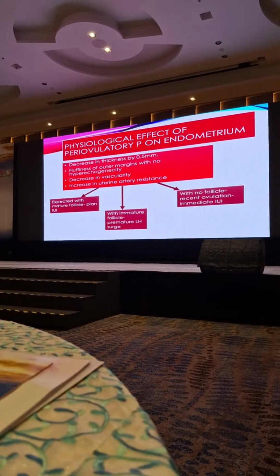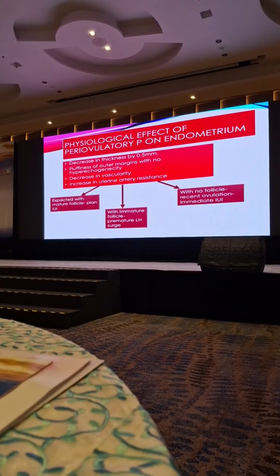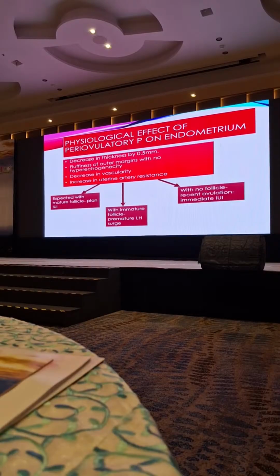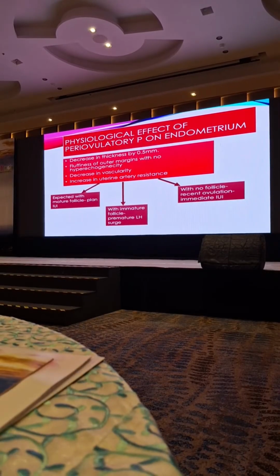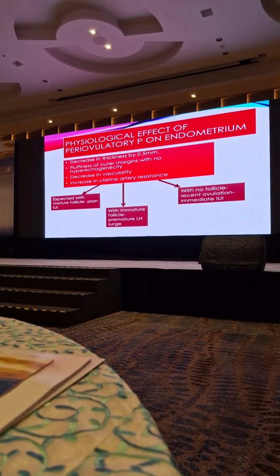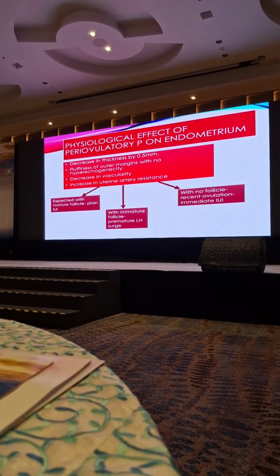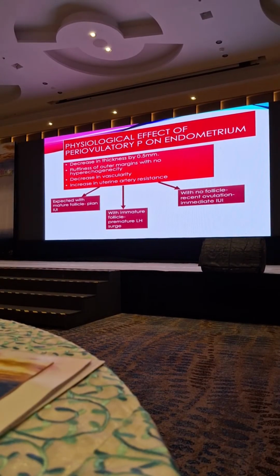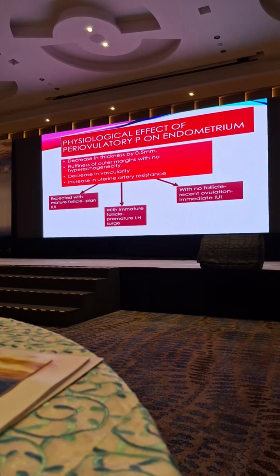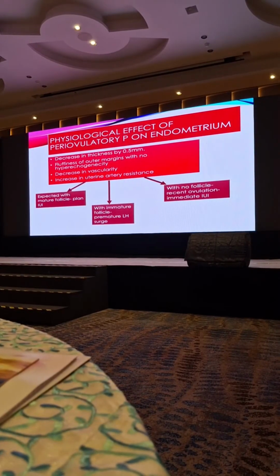If you see that the follicle has already ruptured and you are seeing these changes in the endometrium, it means the rupture has been very recent, because the endometrium still shows fluffiness. This means it is progesterone exposure at physiological levels, and you can go ahead with IUI immediately if it's an IUI cycle. It doesn't happen in IVF because the patient is down regulated.